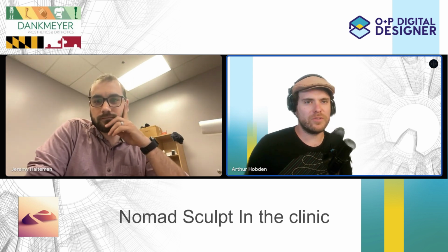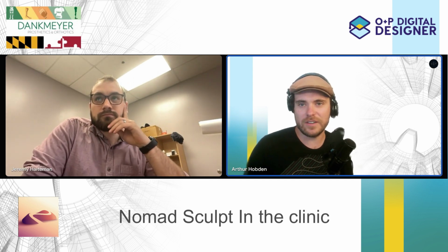Things like designing AFOs. Actually, I had a guy designing an SMO to print this morning, totally in Nomad because of the offset tools that are available. You can shell, you can offset, variable thickness. You can do all that in Nomad. Wow. And can you do latticing or meshing like that of any type?